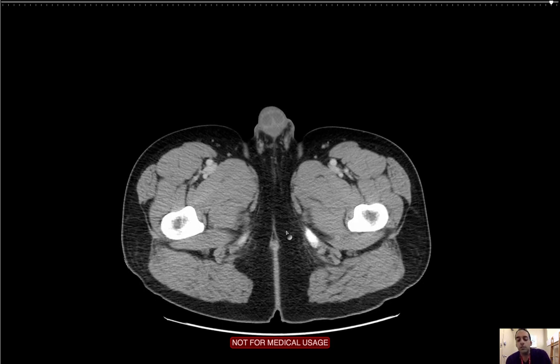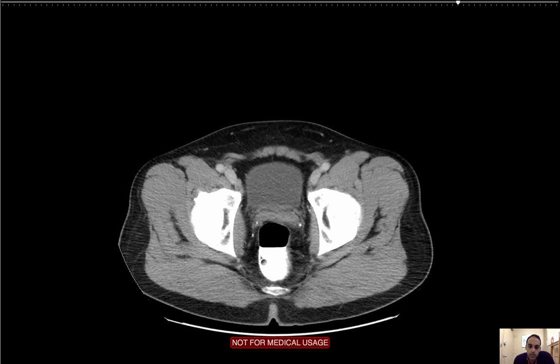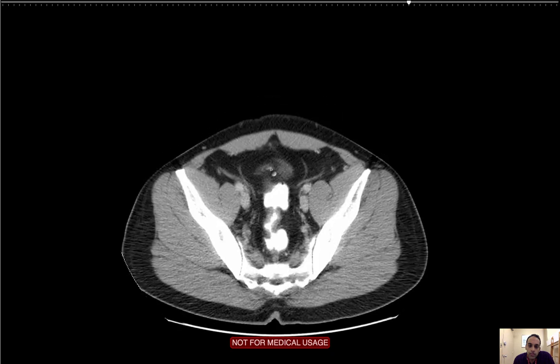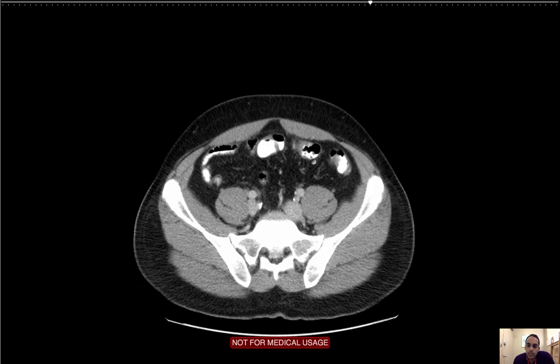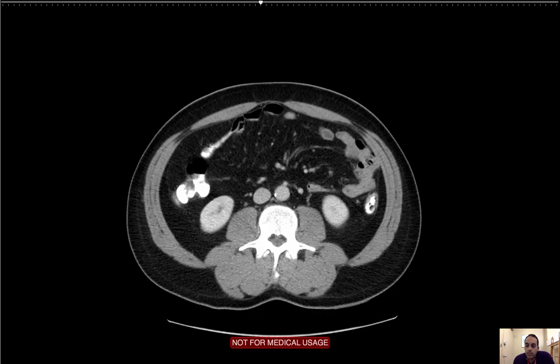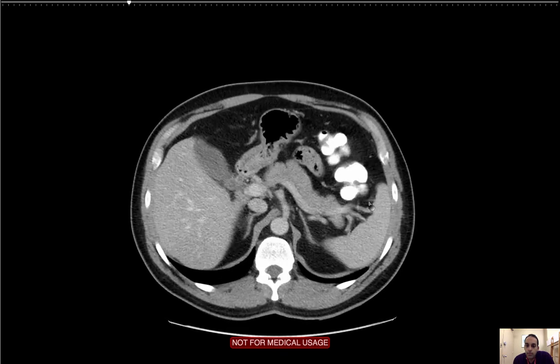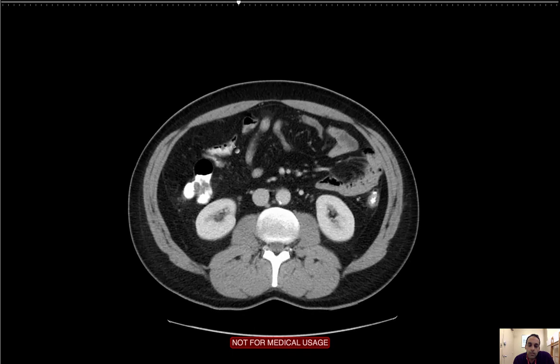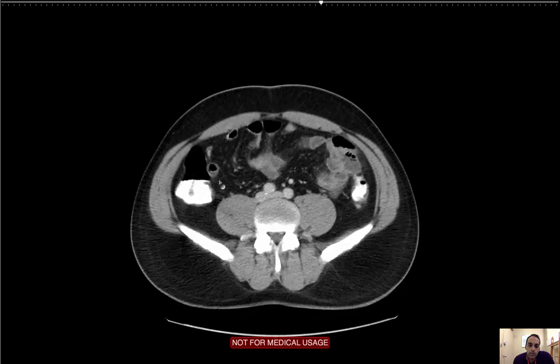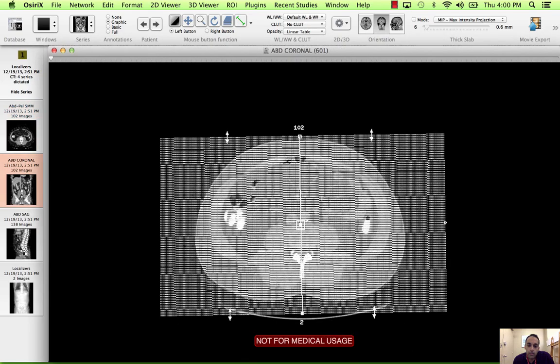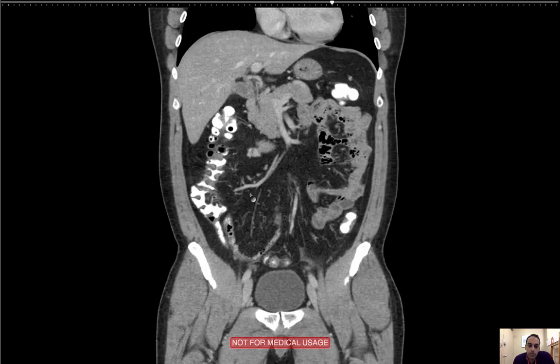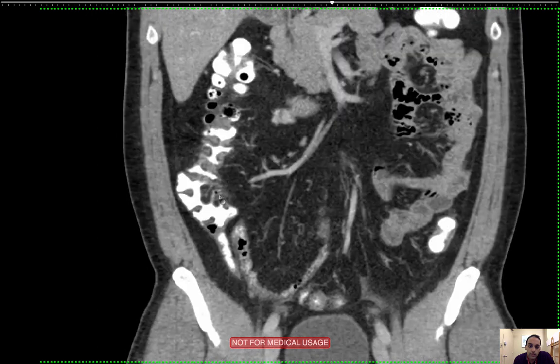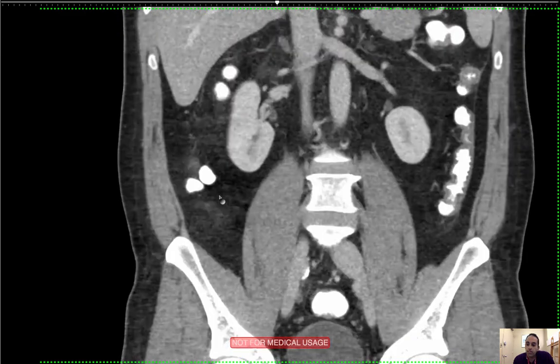Now I'm basically done with the solid organs. I'm going to do the hollow viscera. I'm going to come up from the anus and work my way up. Here I'm seeing the rectum in a presacral location with contrast visible within it. I'm at the level of the sigmoid colon — it's on a mesentery so it comes in and out of the plane. I'm following it tracking into the left side of the abdomen, the descending colon, then the transverse colon. I'm looking for thickening, colitis, or inflammation around the colon — not seeing any. Coming down to the ascending colon, then going into coronal reformats to find the terminal ileum inserting into the colon. I can see nicely the fatty lips of the ileocecal valve. The colon is unremarkable for any thickening or any evidence of obstruction.